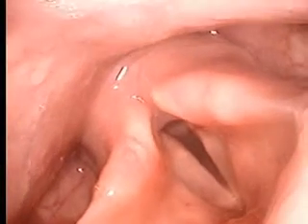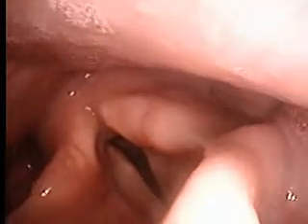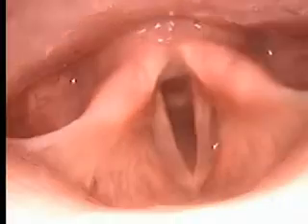The true vocal cords should appear clean, white, and taut. Note throughout any mucosal color or superficial irregularities. While the patient is breathing deeply, the glottis should remain widely open, with the vocal cords abducted. Usually some portion of the subglottic larynx can be seen. The anterior ring of the cricoid cartilage is often visible just below the true vocal cords.